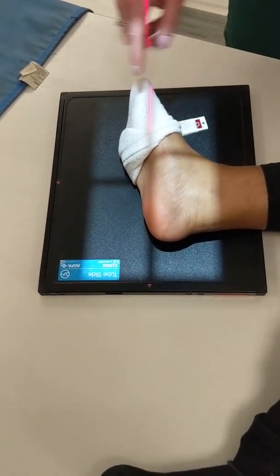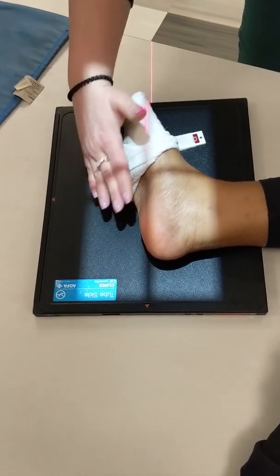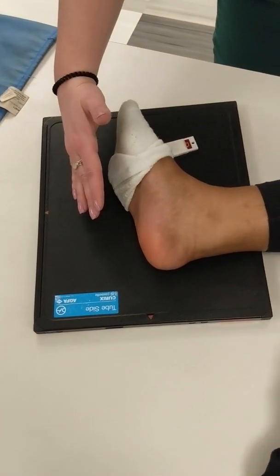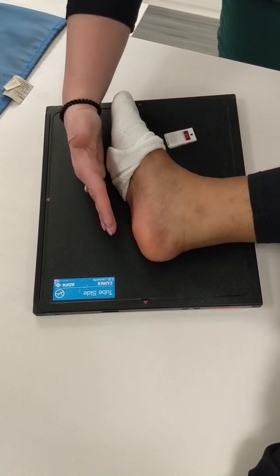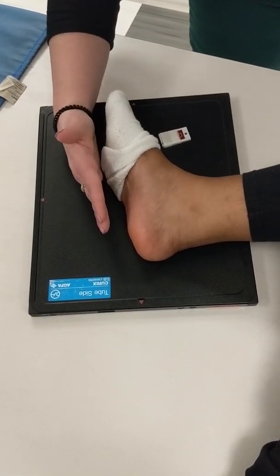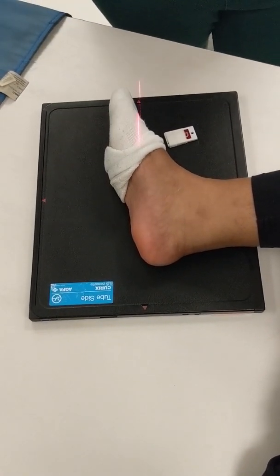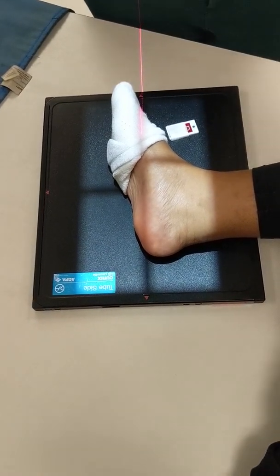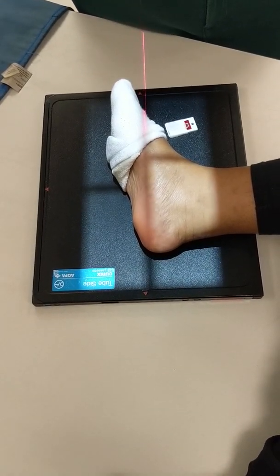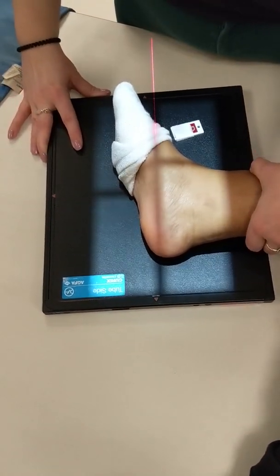Look at the movement in her foot as that happens. As her knee drops, this angle increases. So now what I'm gonna do is bring her knee up just a little bit. So now the plantar surface of her foot is perpendicular with the IR. It did change my centering a little bit because I moved her, so now I'm just gonna double check that. Get that back in there. Lift up just a tiny, tiny bit, okay?